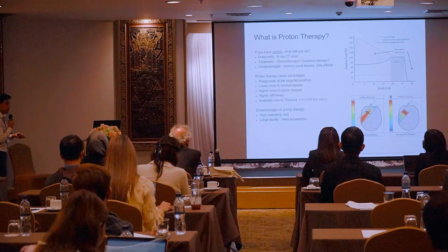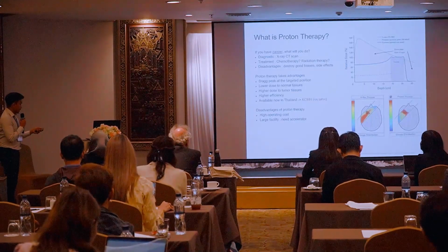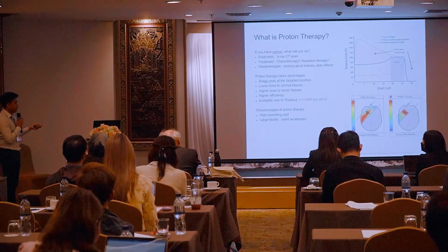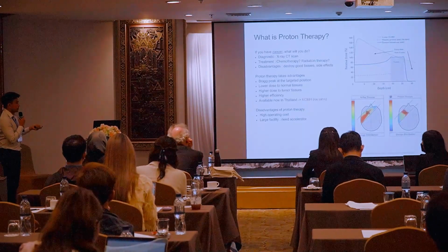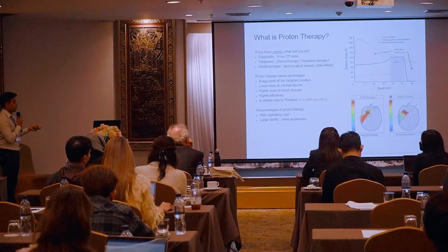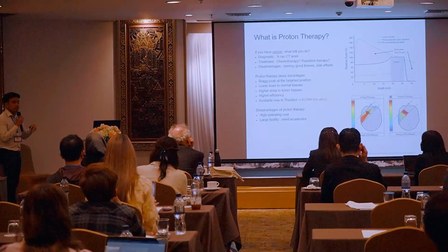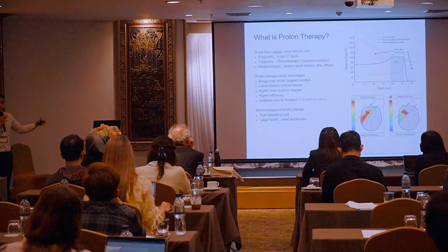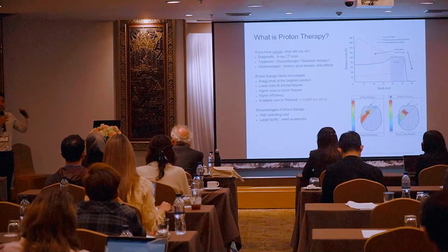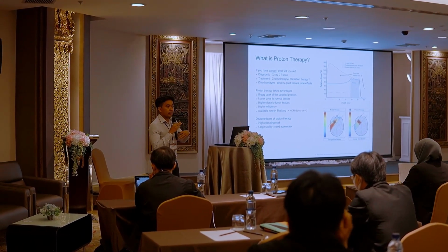But what is the problem here? As you can see from the picture of Dr. Chakapong this morning, when the doctor prepares to do proton therapy, they have to make the treatment plan. The treatment plan means drawing in which direction the proton shooting goes and how much dose the proton has to deposit there. But the image that comes from the diagnostic part is the image from X-ray CT, right? Let's imagine what X-ray CT is. X-ray CT is a black-and-white gradient picture, or 3D modeling. This means the picture tells you how much your organs or tissue absorb the X-ray, but not how much the proton will deposit inside that tissue, right?